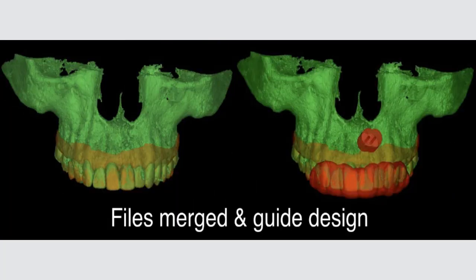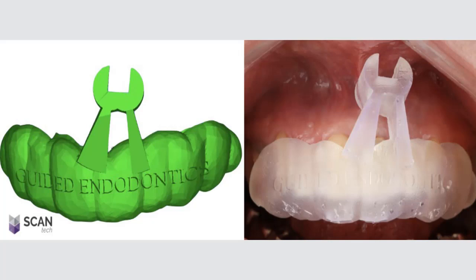Then you go and you design a guide to reach the apical component of the tooth right where it should. So this would help us significantly. One can see, Nelson, I see this too thick, right, on the buccal side. Yeah, this was the first one we have done.